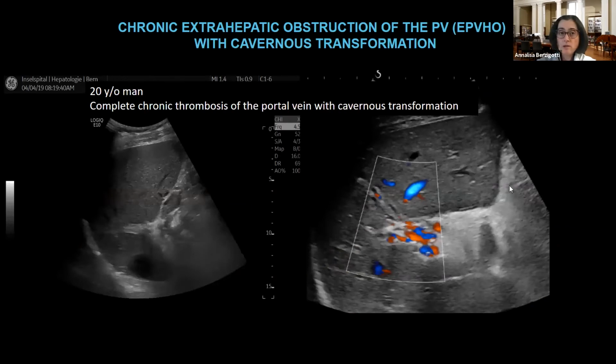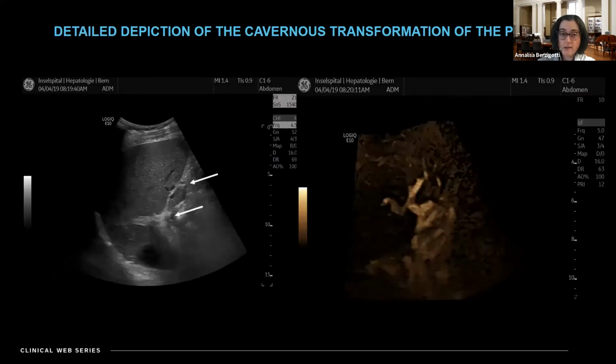This is a case of a patient with known chronic extrahepatic portal vein obstruction, so-called portal vein thrombosis in a non-cirrhotic liver. You can see that the liver is remodeled, and you can see lack of standard flow and substitution with a cavernous transformation. But if I have to say something more on this power Doppler imaging, I cannot say much more. And moreover, I cannot study very well where the collaterals are directing into the flow.